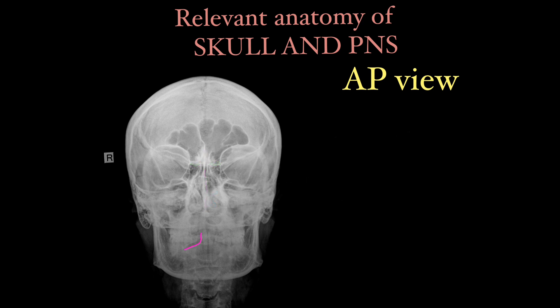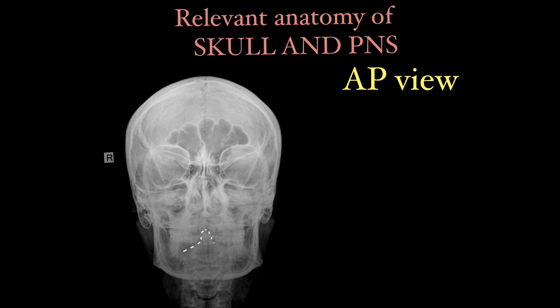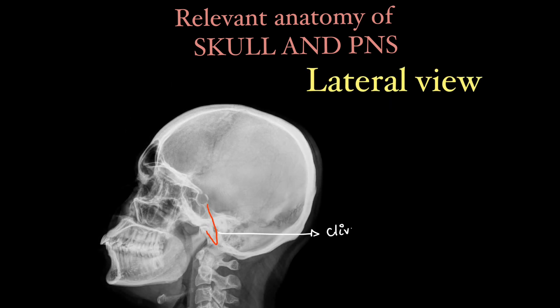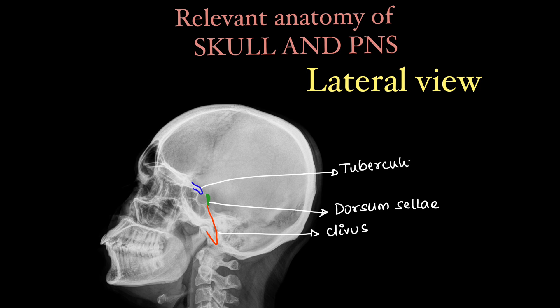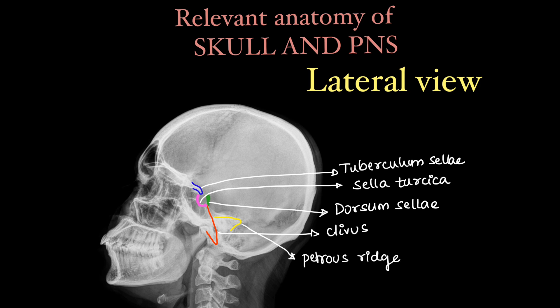Faintly visualized in the AP view is the C2 vertebral body or the axis bone and its process — the dens. Here you can see the dens and axis. Coming to additional structures on lateral view, we can see the clivus, the dorsum sellae, the tuberculum sellae, and the fossa which contains the pituitary — that is the sella turcica. We can see the petrous ridge.